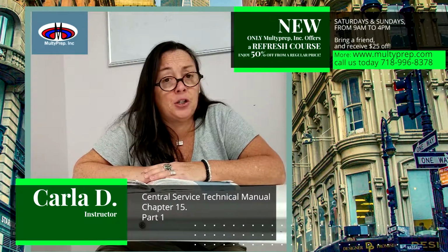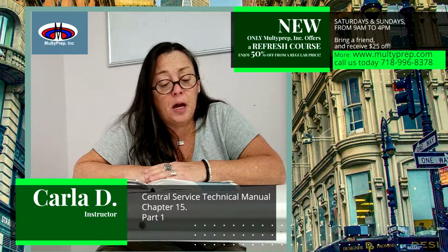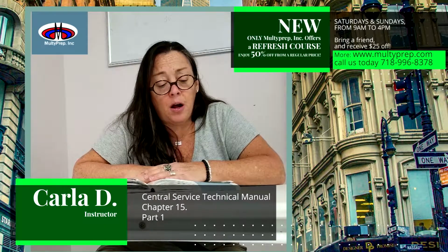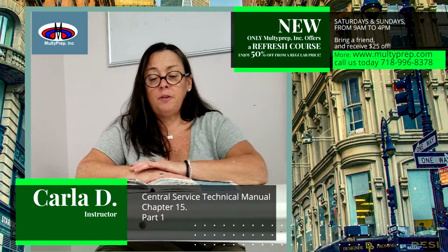Definition: oxidation. Oxidation is the process by which several low temperature sterilization processes, including hydrogen peroxide gas plasma, vaporized hydrogen peroxide, and ozone, destroy microorganisms. Oxidation involves the act or process of oxidizing, which is the addition of oxygen to a compound with the loss of electrons.